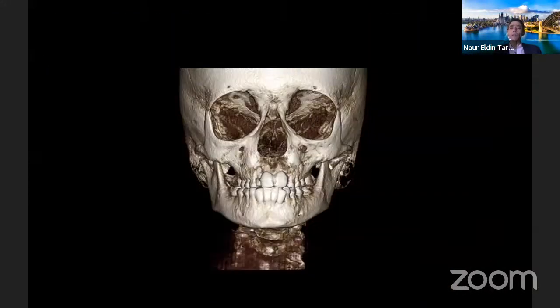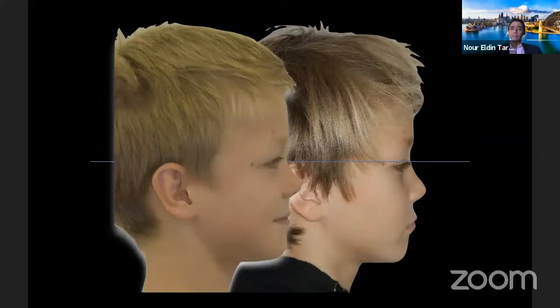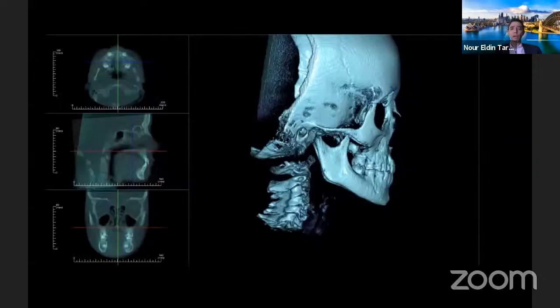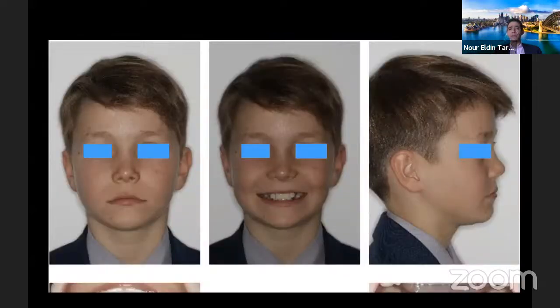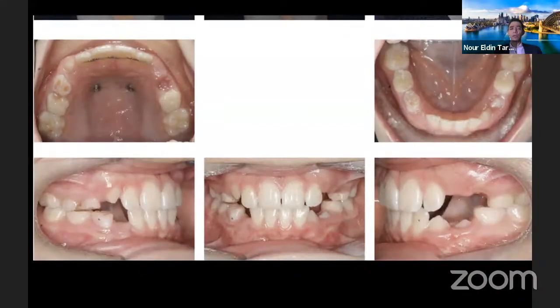Now, if we look at the level of the bone, what's happened here, this is the pre-treatment CBCT, and this is after. It's a massive change at the level of the nasal cavity. Not to mention at the level of the maxillary growth. We are wearing a face mask here as well, and that's because he's also maxillary deficient in the anteroposterior dimension. So you can see that the maxilla will also grow downwards and forwards in that sort of scenario. And then this is a few years later now, he's more grown up, the permanent dentition is erupting and he's maintaining his class 1 occlusion.